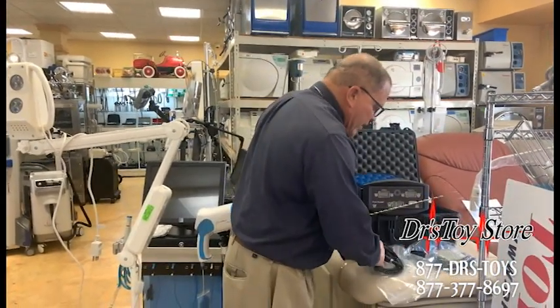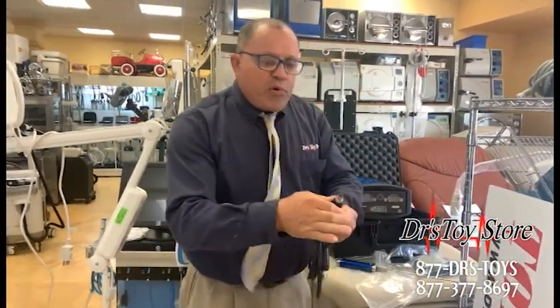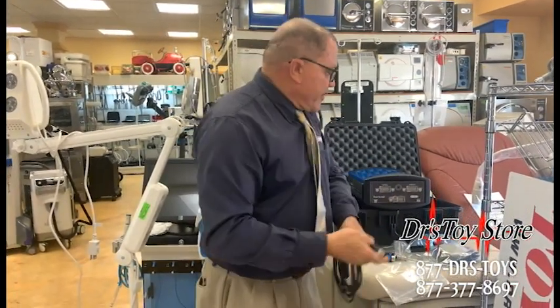Then you take the cord — same thing when you autoclave, these little things must be on. Also, when you pull this off the machine, don't pull it from the cord — always pull from this black part. Very important, okay?